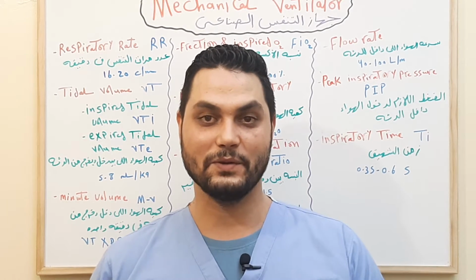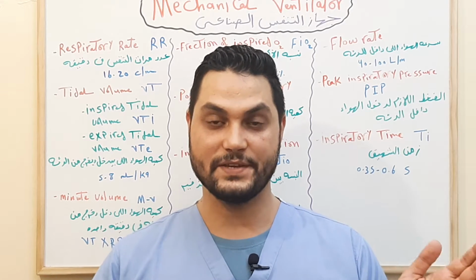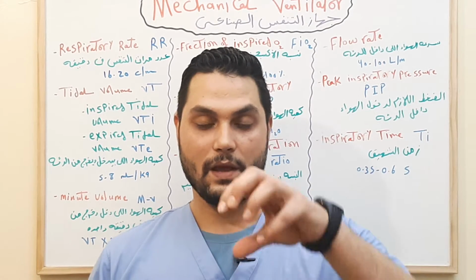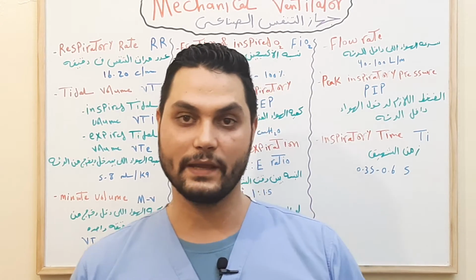Today we will speak about mechanical ventilator. How mechanical ventilator works, what are the abbreviations that appear on the screen of mechanical ventilation, how we will wean the patient on mechanical ventilator. Finally, what is the nursing intervention, what will we do with the patient on mechanical ventilator.